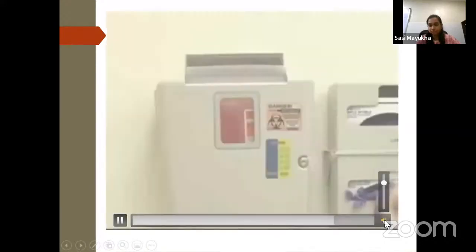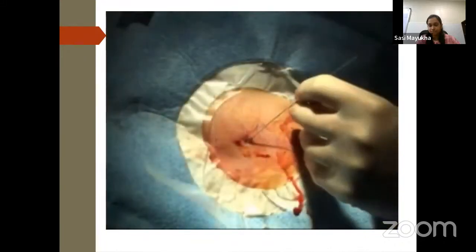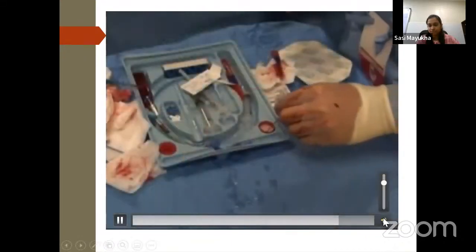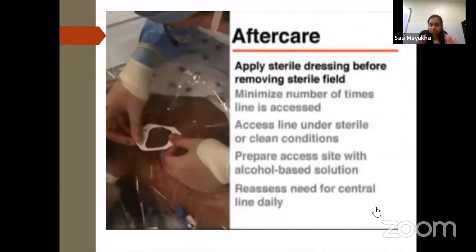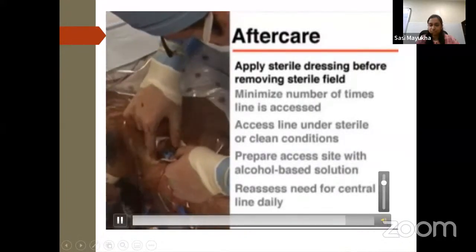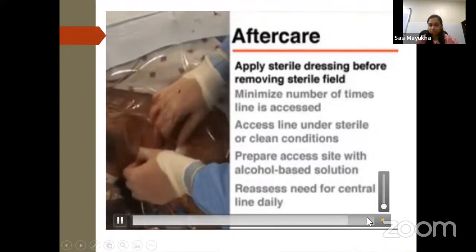All sharps should be properly disposed in approved sharps containers. Scalpels should be retracted into their protective sleeves. Needle stick injury can be minimized by using needle lock devices found in most commercial central line kits. Sterile dressing should be placed on the insertion site. The dressing should be changed daily, and whenever blood or liquid accumulates or it loses its seal.